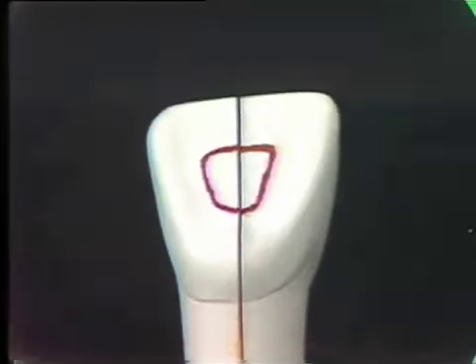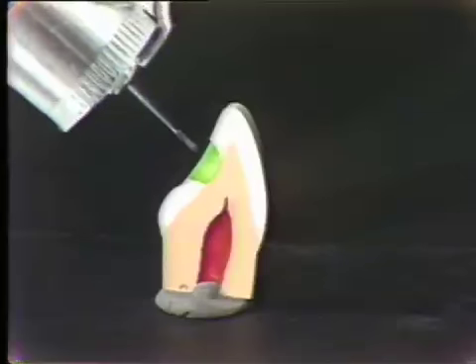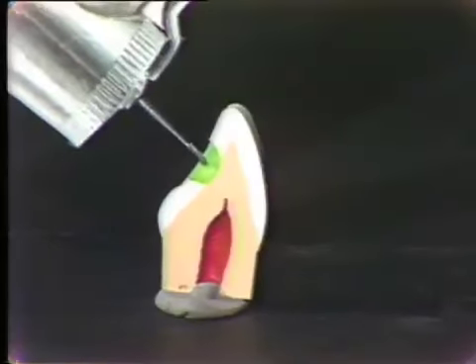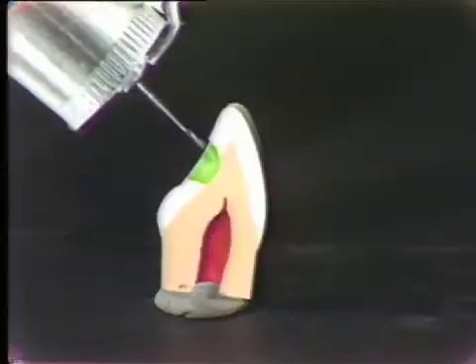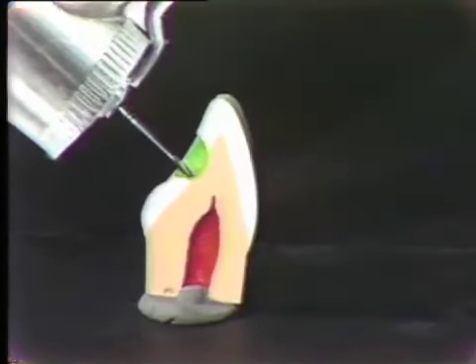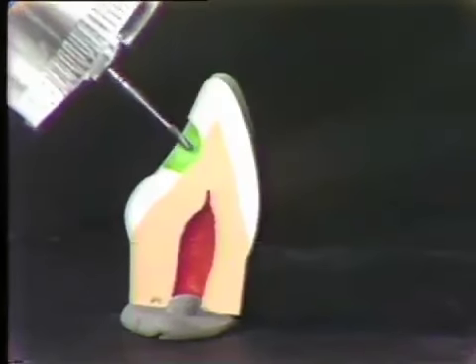The third step is to establish your tentative outline form in the enamel with a high-speed 1057 burr. You hold your high speed at right angles to the surface of the tooth, so the burr forms a right angle with the surface of the tooth. You penetrate through the enamel to the dentin. You extend this laterally until you've roughed out your tentative outline form in enamel.